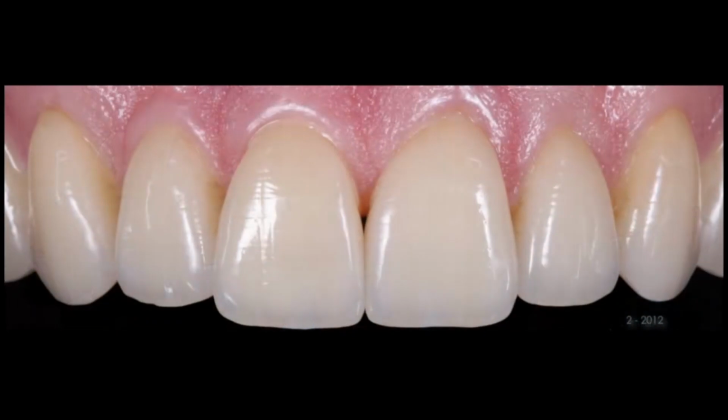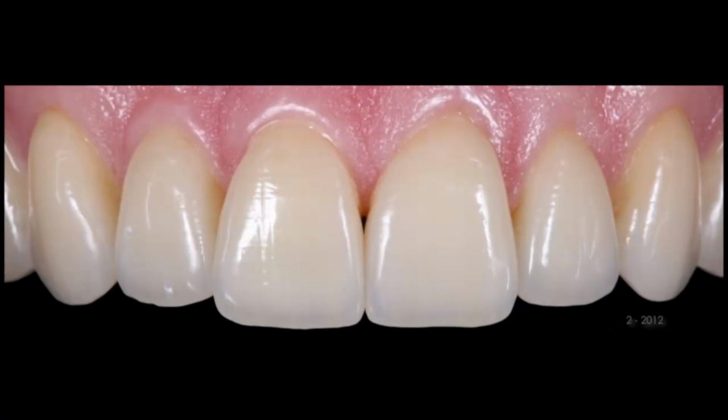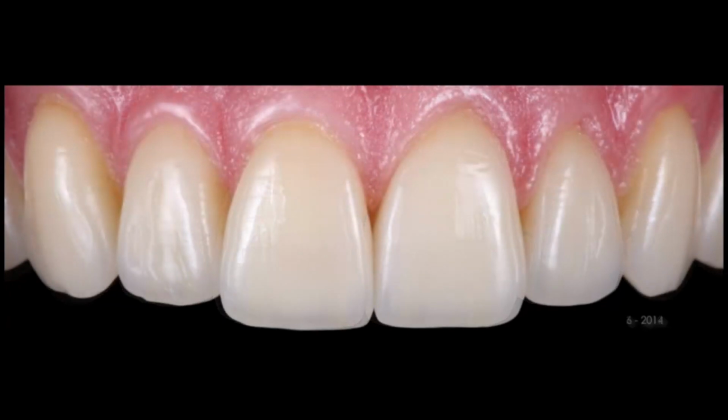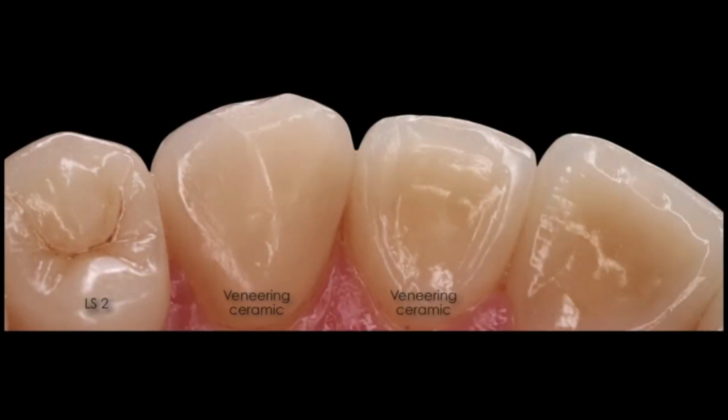And we took pictures, and you see, this is 2012, this is 2.5 years later, and you see some wear facets, extremely high wear facets over here. You see the canine? So he follows again the pre-existing patterns. And this is something we always have to keep in mind, that they go back into the patterns that they have. Even though he's wearing a night guard, the compliance is very low, I have to say. You see the wear is not only shown on the veneering ceramic, it can also be seen on the lithium disilicate ceramic. So this is something bad, but also something positive.